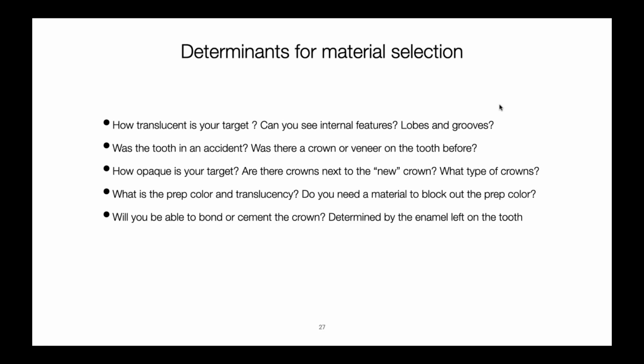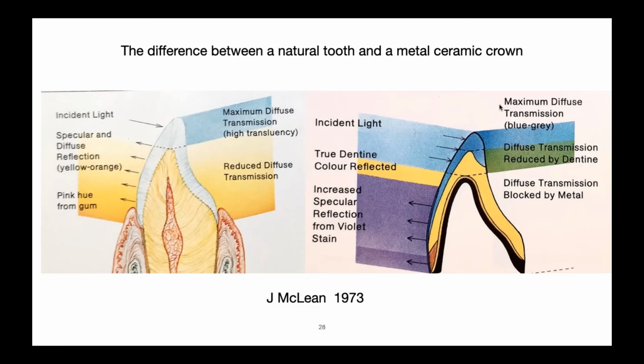So there was a clinician that was doing zirconia veneers, and they were falling off. And I'm just shaking my head like, okay, if you fire dentine on the inside and etch it, you have a chance. But if there's no enamel left, or you've had 2 or 3 type of crowns, there's very, very poor enamel left on the tooth to really get a good bond on a veneer.